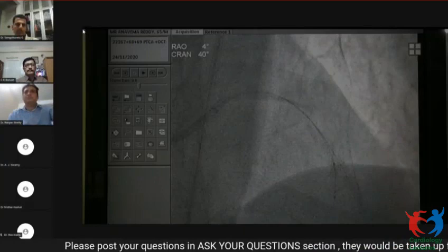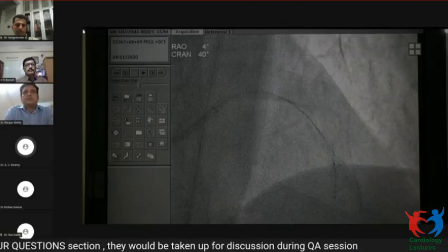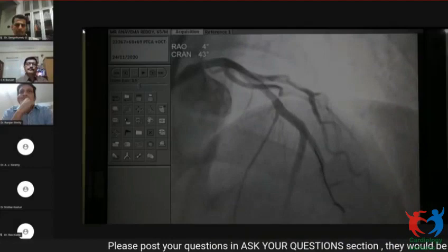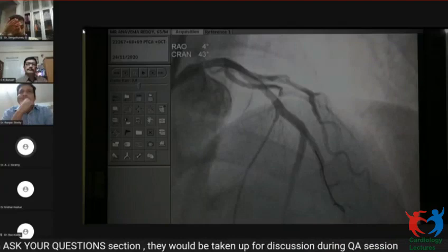So we were trying to see the kiss actually. We didn't see the final kiss. First kiss, go to the final kiss I am doing now. Okay, yeah. Okay, fine. So we have crossed now and we are just doing the final kiss. Final kissing. Okay. Yeah. 2.5.